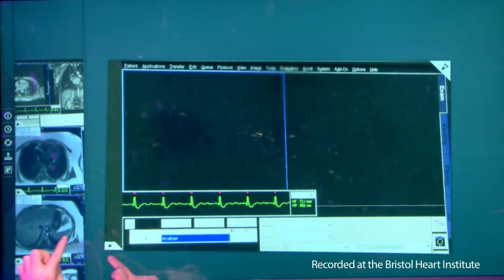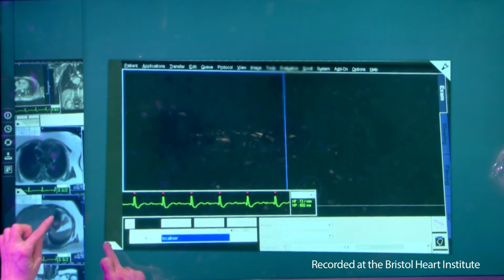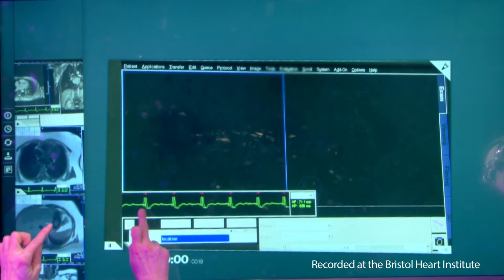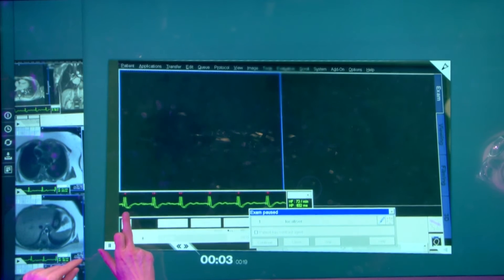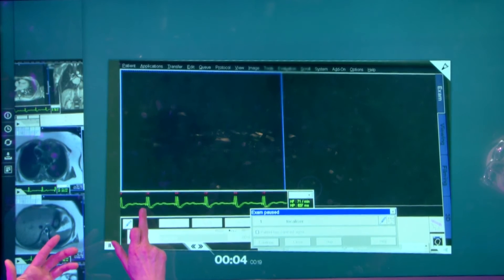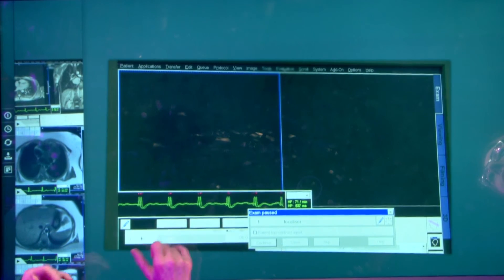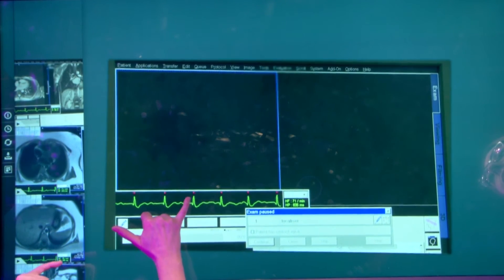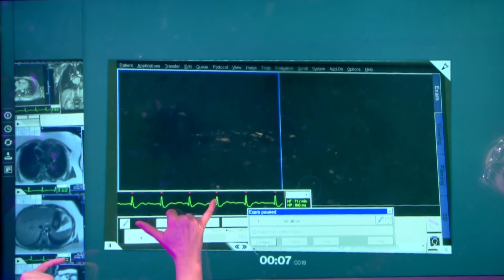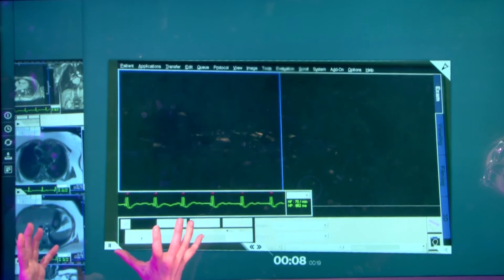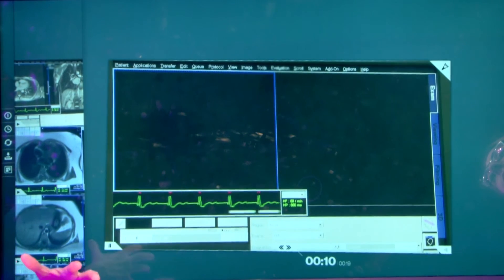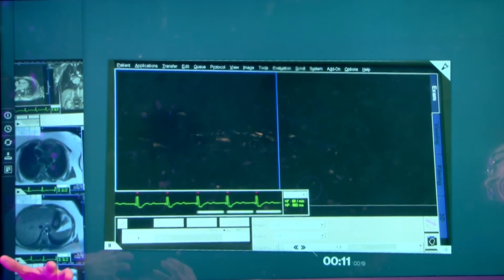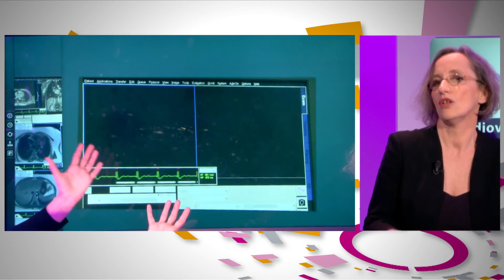That means at first you have the ECG — you see just the quality of the gating, following that red dash. That's extremely important. Running a CMR without a good trigger quality, you can just stop it.